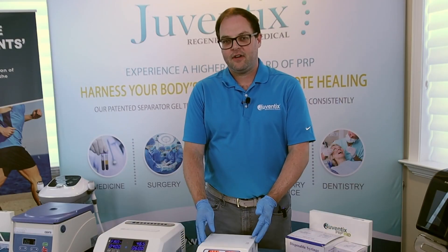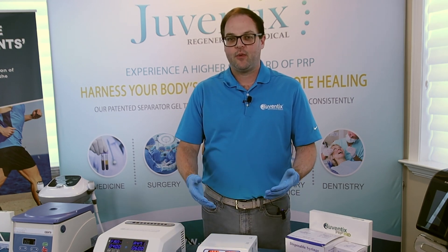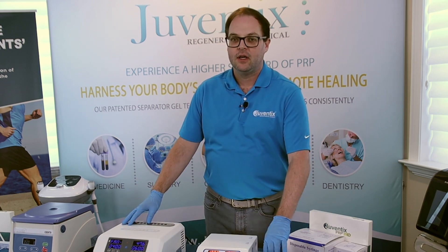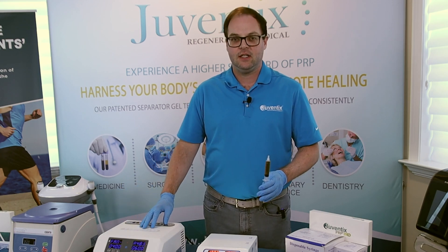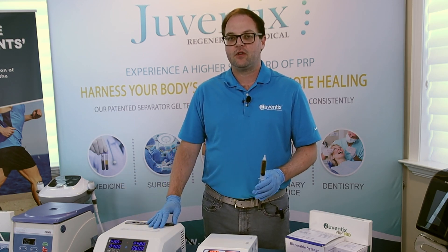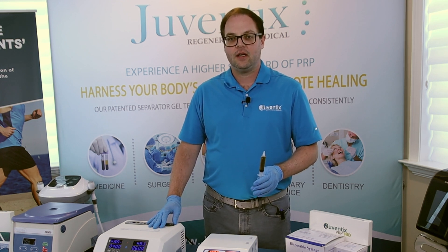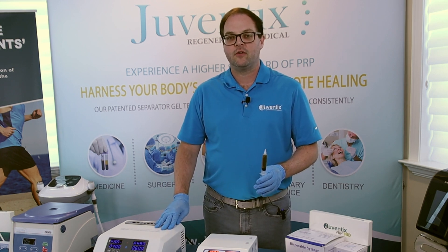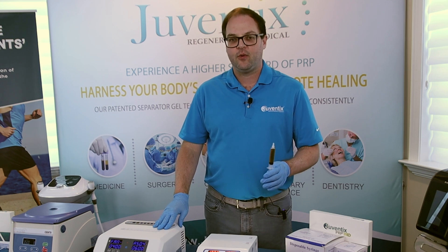Now that photoactivation is complete, we're going to demonstrate how to transfer the photoactivated PRP with greater potency into individual syringes for bioincubation. Bioincubation can be achieved in syringes anywhere from 1 to 5 cc in size. A larger syringe would be appropriate for preparing platelet-rich fibrin for procedures such as wound care or an orthopedic injection. Today we'll be utilizing 1 cc syringes, which are the recommended preparation for aesthetic procedures such as dermal filler in the face and other parts of the body.